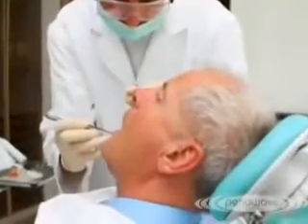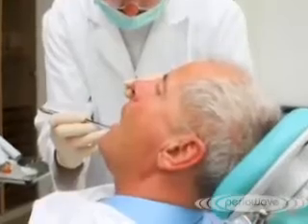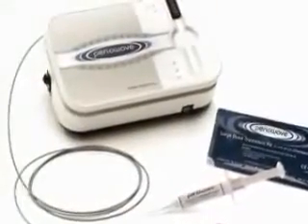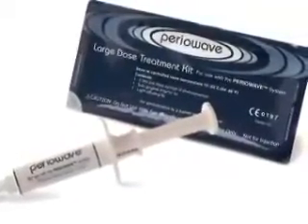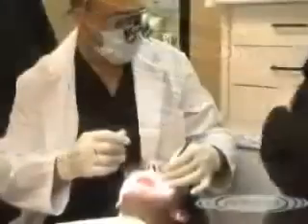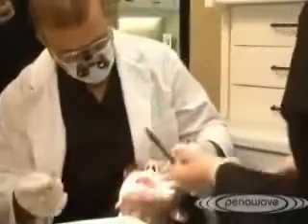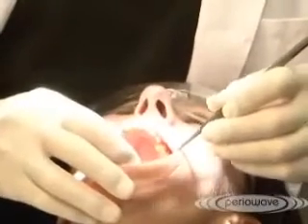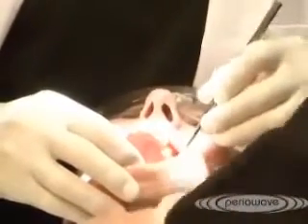There is a growing awareness of serious health consequences associated with gum disease. Clear evidence has emerged implicating it as a major health risk. As a result, patients and dentists alike are looking for solutions. Clinicians may opt with at-risk patients to pre-treat with PerioWave prior to scaling and root planing in order to destroy the harmful bacteria associated with gum disease and minimize the bleeding that will occur during instrumentation. Dr. Joseph Andery describes the process.